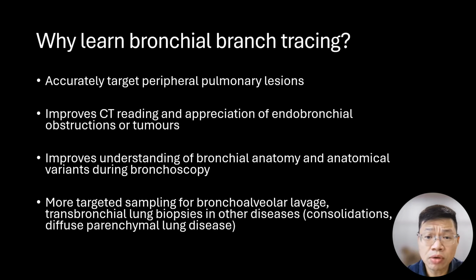Understanding airway mapping also improves our CT reading and appreciation of endobronchial obstructions or tumors, and increases our understanding of bronchial anatomy and anatomical variants during bronchoscopy. This also allows us to perform more targeted sampling for bronchial alveolar lavage or transbronchial lung biopsies in other diseases such as diffuse parenchymal lung disease or interstitial lung disease.